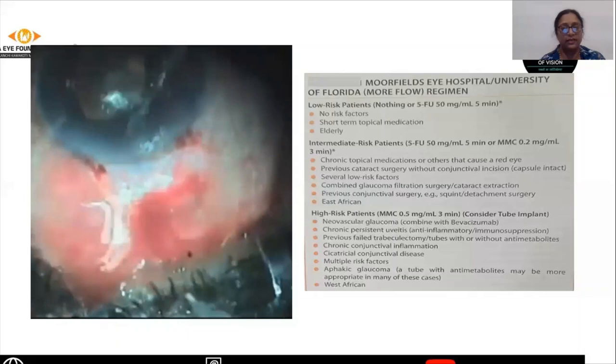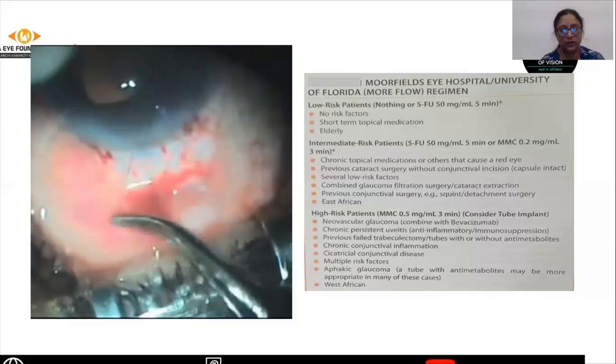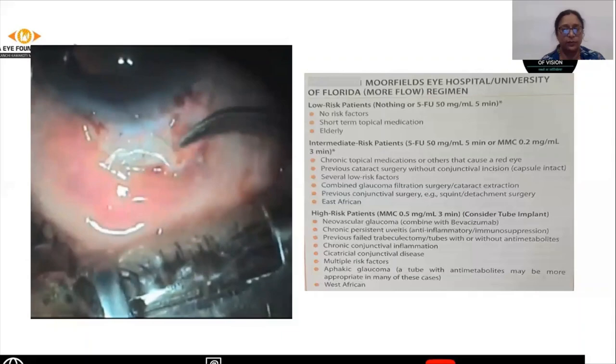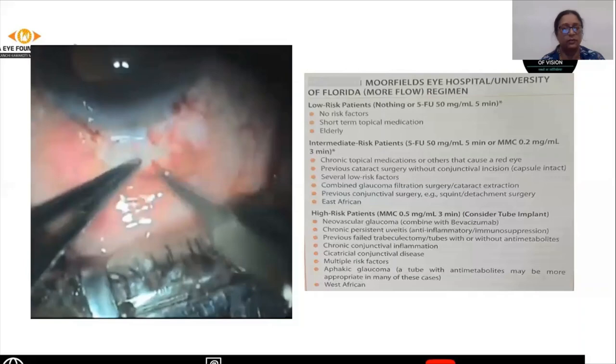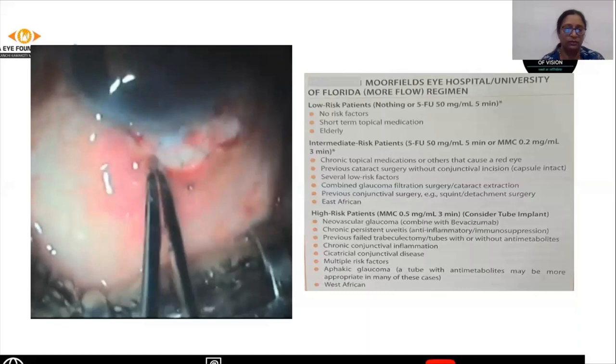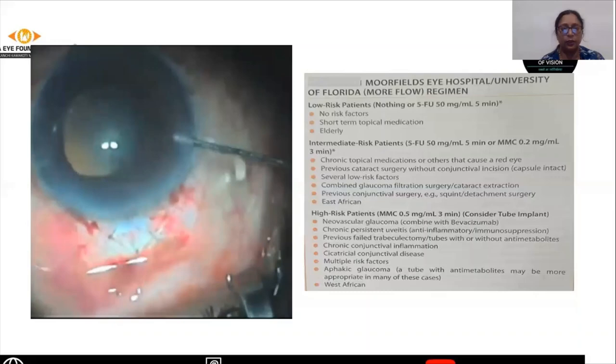The flap is sutured using 10-0 nylon. The various methods for using the sutures are the fixed sutures, the releasable sutures, and the adjustable sutures, depending upon the surgeon's convenience. Various permutations and combinations can be used. It could be all three fixed sutures or all three releasable sutures or any combination. These sutures have to be buried onto the sclerostomy to prevent conjunctival erosion later during the post-operative life of the trabeculectomy.